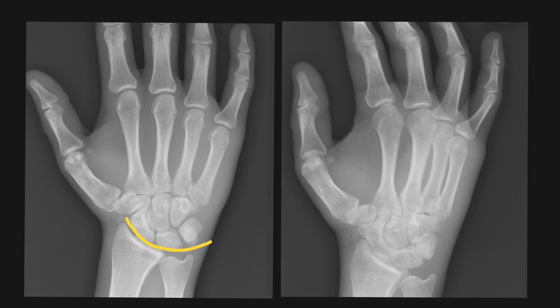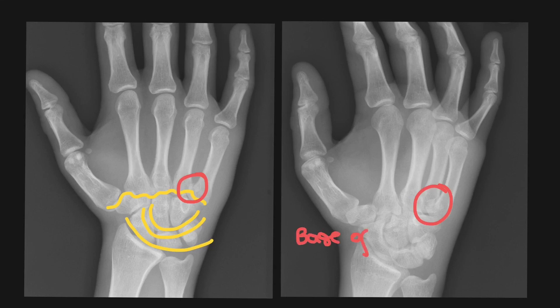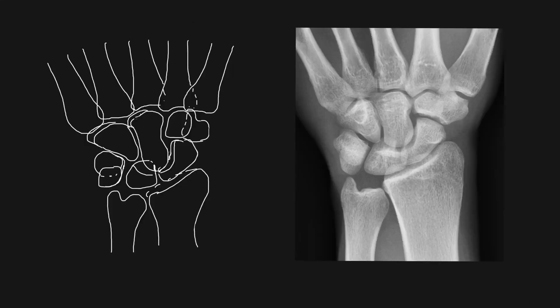On this particular case when we look at the carpus we can see that the arcs are intact, however there is an abnormality at the base of the fifth metacarpal in keeping with a fracture. In summary we have talked about the common injuries including fractures and dislocations of the carpal bones.